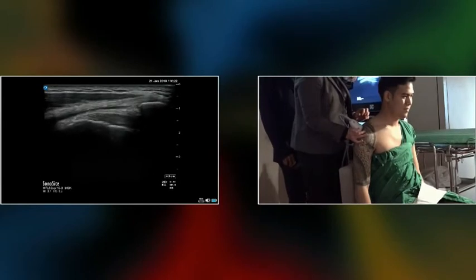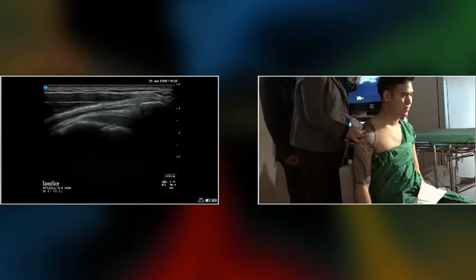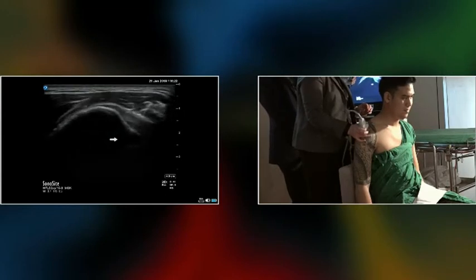It's also good to examine, this is to show you the tendon and its fibrillar pattern, the fibrillar alignment. And then you can see the fascia and everything; the alignment is very nice.